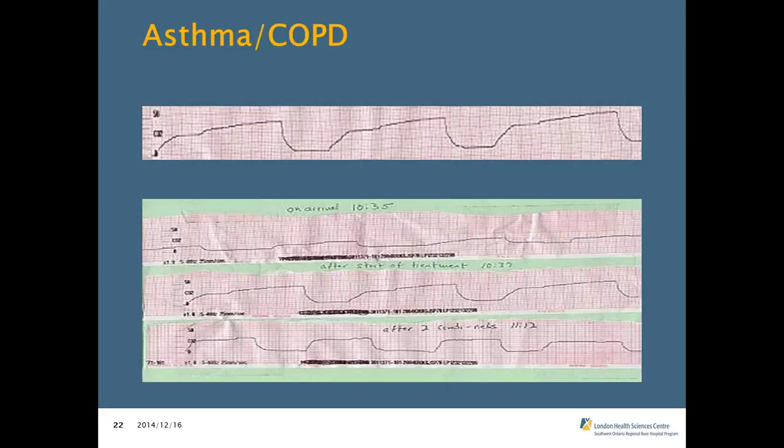Of course, we're always going to examine our patients, but this is one application of EndTidal CO2 that is applicable to our setting. Absolutely. I mean, this is some real-time quantitative feedback for the medics. Again, as Christine said, you're going to be taking this in the clinical context of your patient. So, your patient's looking better.